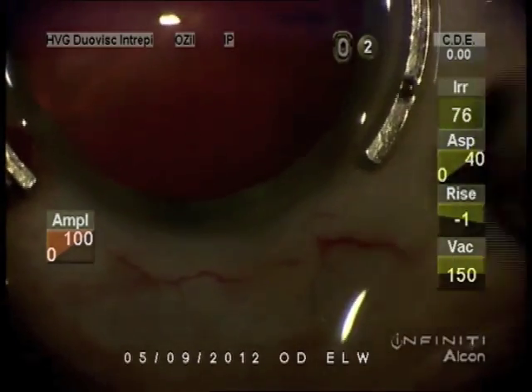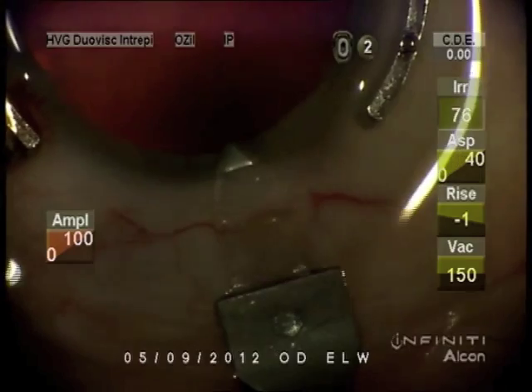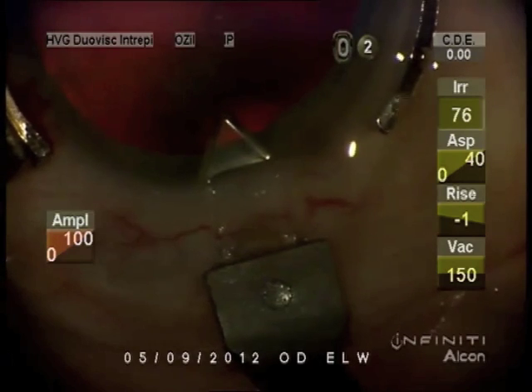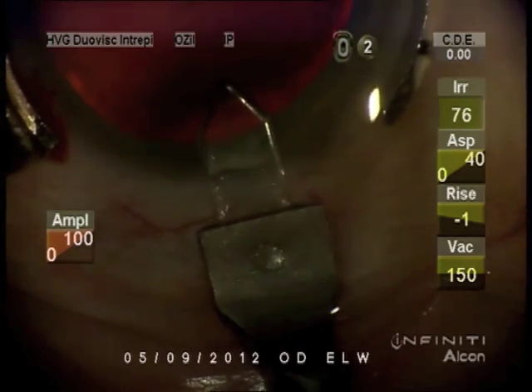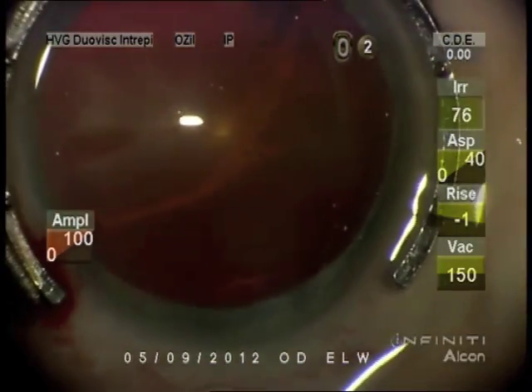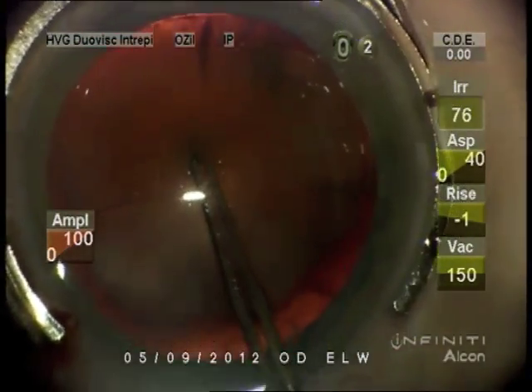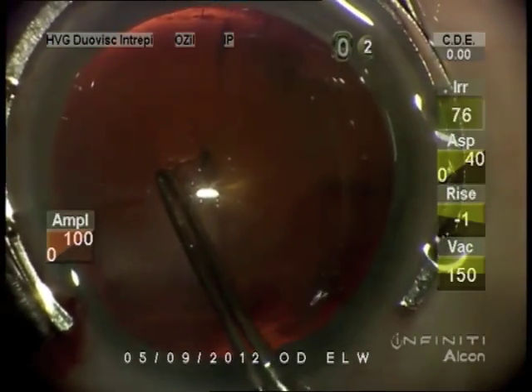I like to make a little grooves so I can start deep in the tissue with the clear corneal incision. Diamond knives are made by Mastel. You're just starting your cataract surgery. Okay. Just made the incisions.